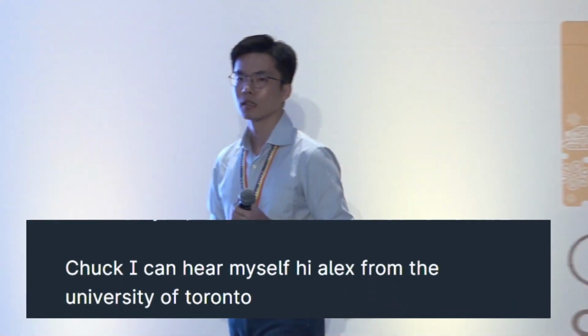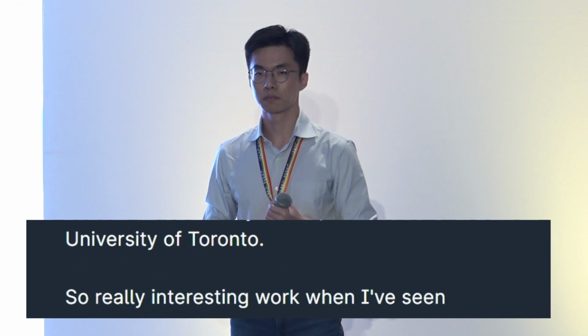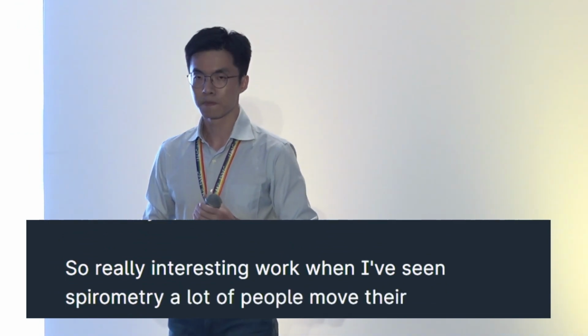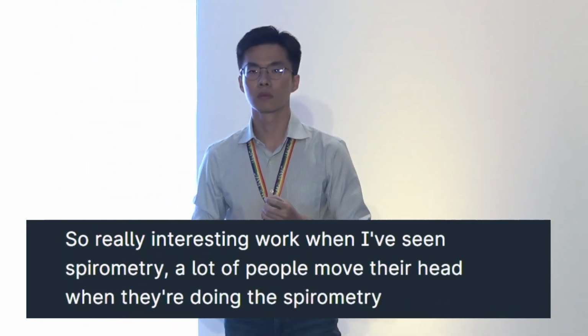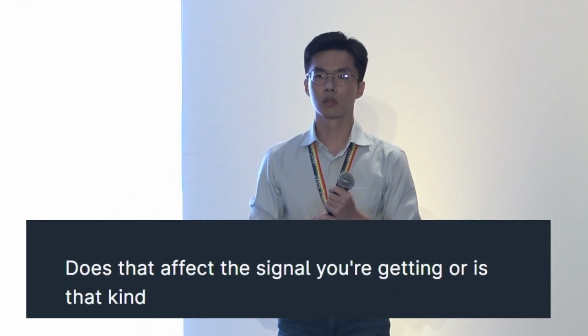So really interesting work. When I've seen spirometry, a lot of people move their head when they're doing the spirometry effort. Do you see that? Does that affect the signal you're getting, or is that kind of a non-factor because you're using the in-ear microphone?